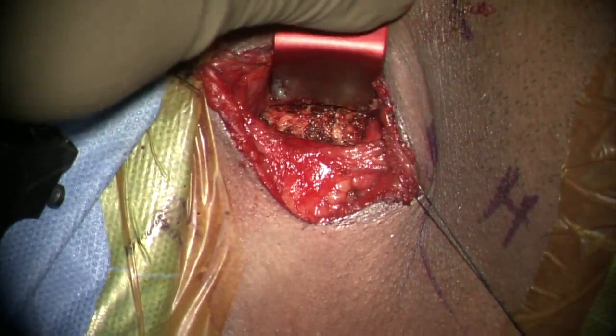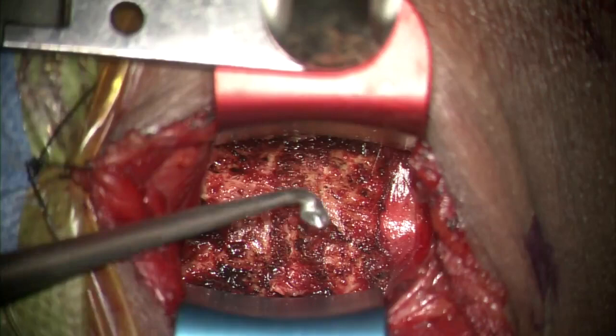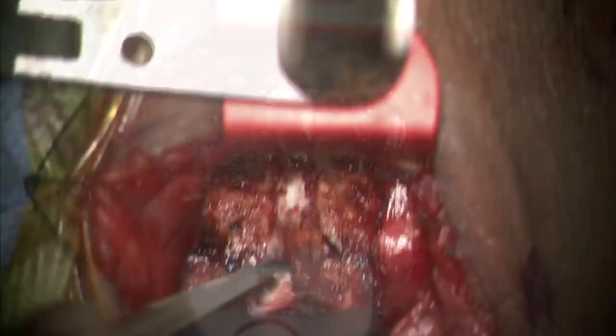The anterior annulus of the affected disc is incised using a number 15 blade on a long handle, and the sharp end of the blade should always be pointing away from the midline. Disc material is scraped off using a curette until the uncovertebral joints are clearly visualized.